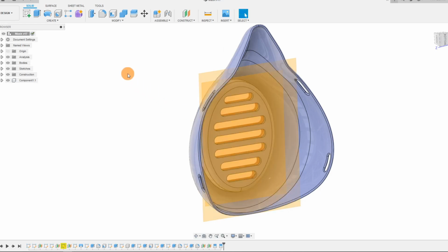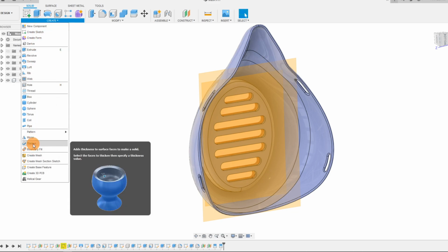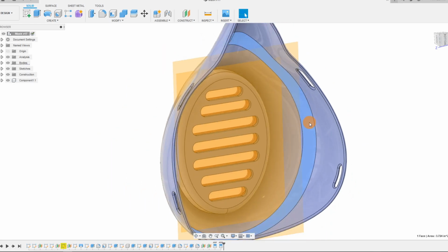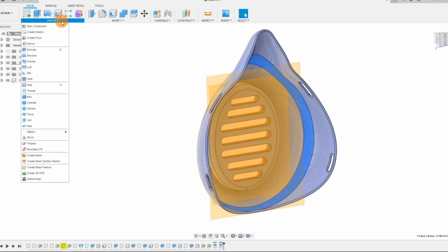So what we're gonna do is we need to effectively create a thicken. So I'm gonna come to Create, Thicken, and I'm gonna select this face here. Now, if you're having a hard time selecting this face, and it may not be possible, what we may need to do first, which it seems like it's the case, is we need to do a surface offset.